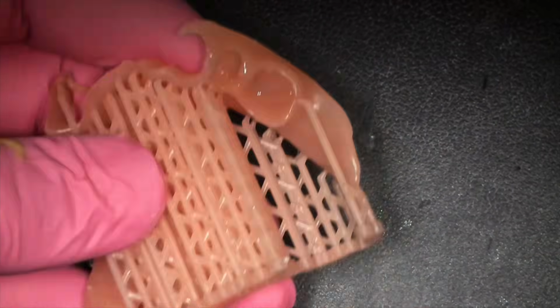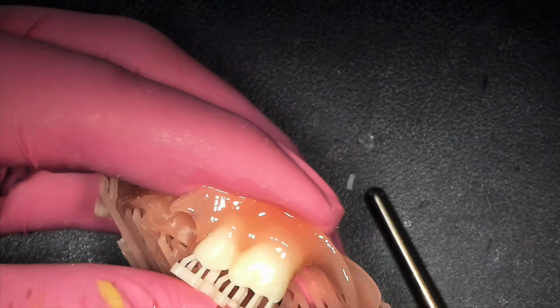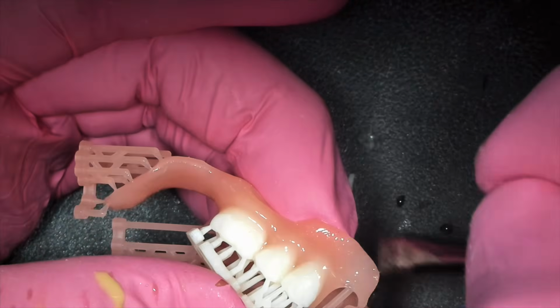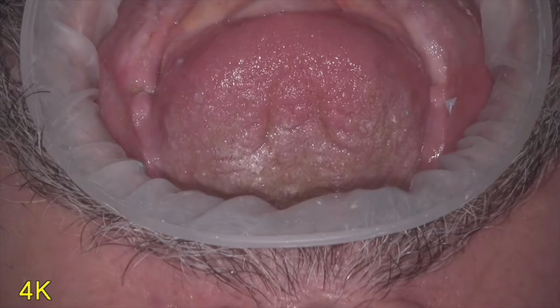I'm going to remove the supports from the sockets, but keep them everywhere else. And then I'm going to put Flex partial denture material in the pockets and tack cure. I candy coat the clasps and everything that I can, because it'll come out super shiny and smooth. And just a super thin coating on the pink there with the excess resin that gushed out of the pockets. And we're going to drop that into the curing unit. It's going to cure and everything. I'm going to pop off those supports and give it a little polish really fast. And let's see how everything fits.